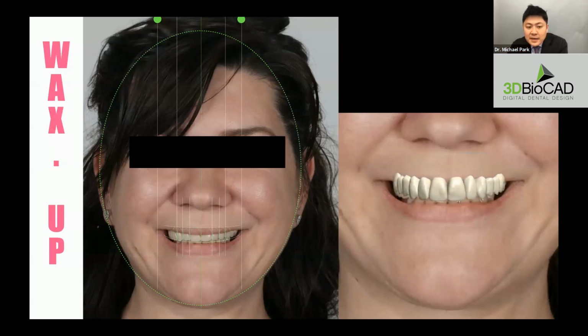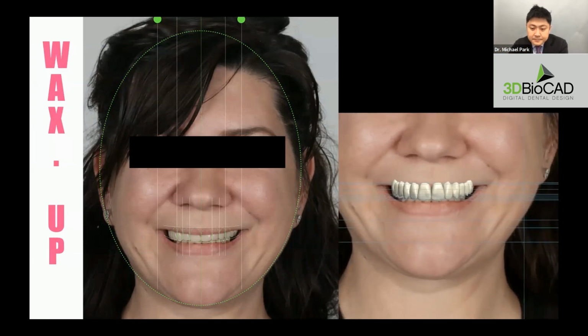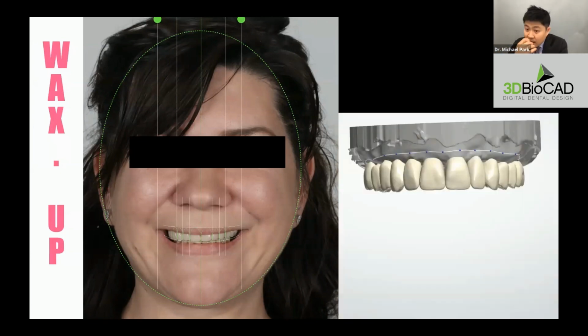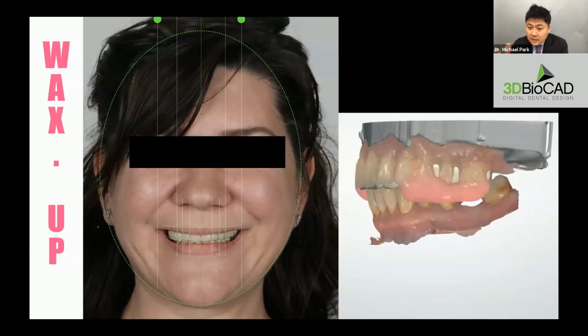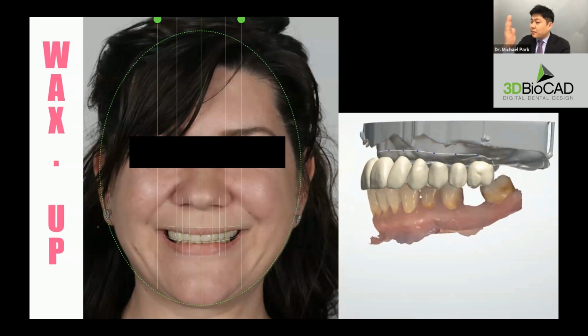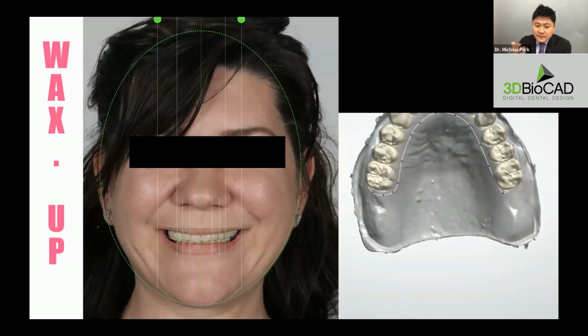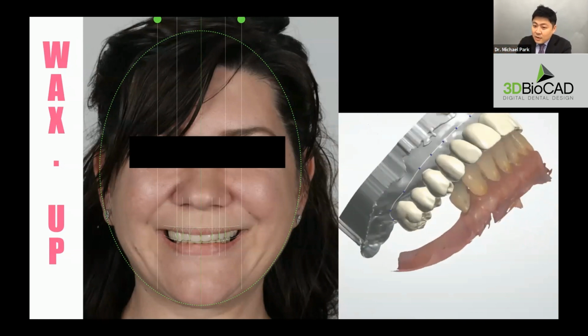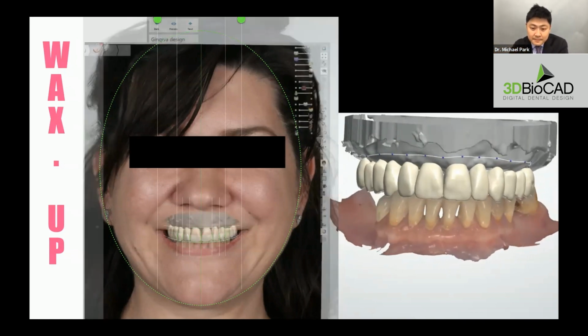Based on the digital smile design that I did, my technician did the wax up. If you look at this wax up, especially from the side, you're going to notice that compared to the denture, it's brought in quite a bit. That's because we can't have the teeth too far out since there's no flange on a fixed restoration. Okay.